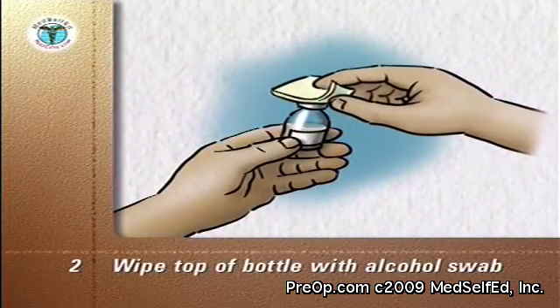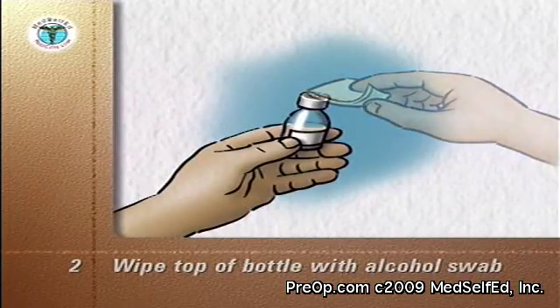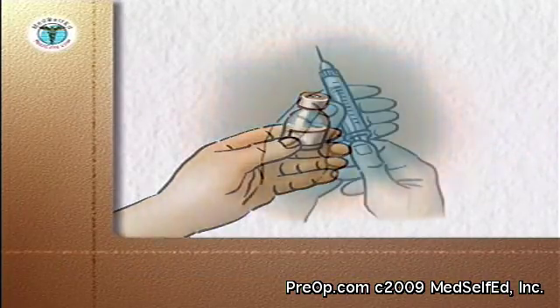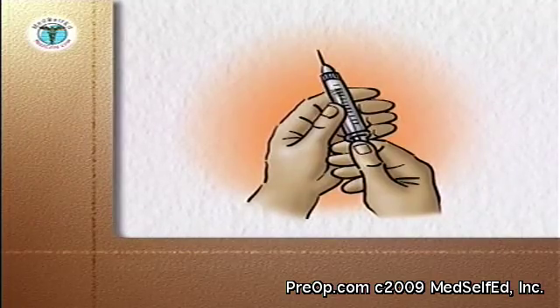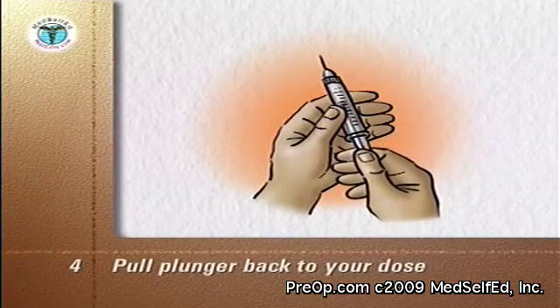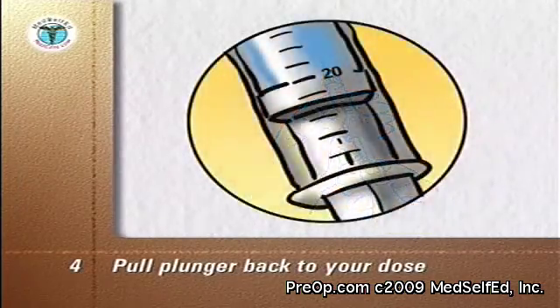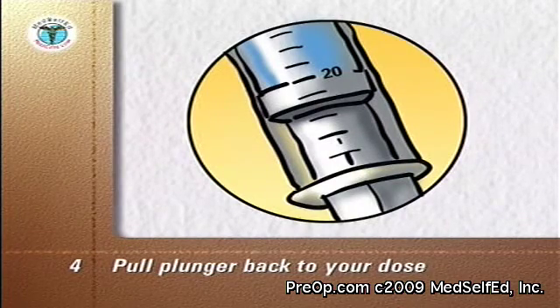Wipe off the top of the bottle with an alcohol swab. Discard the swab. Pick up the syringe and remove the needle cap. With the syringe held upright, pull the plunger back until the end of the plunger is at the mark of your dose, which in this example is 20 units. There is now air in the syringe.